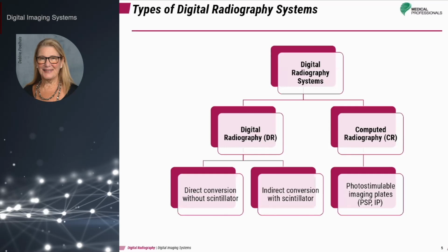So that's one of the main differences between computed radiography and digital radiography. Again, in computed radiography, the plate must be erased to be used again. In digital radiography, it is immediately ready for the next exposure. DR uses flat panel detectors with thin film transistor technology that are categorized as direct capture or indirect capture.